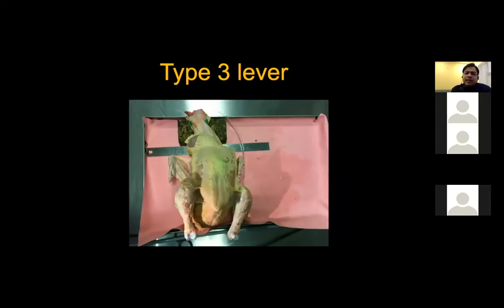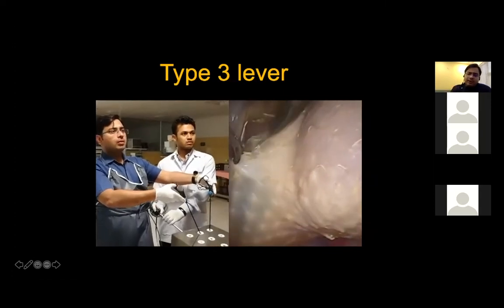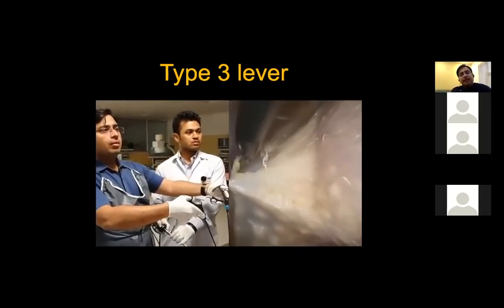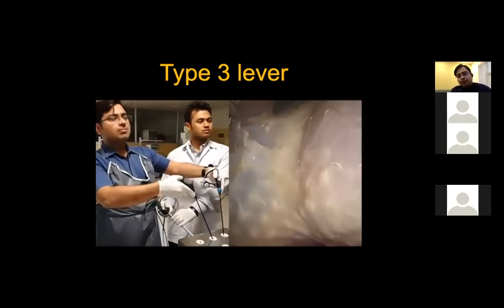One more situation that can arise is that your instrument is too much outside. That means 3/4 of your instrument is outside and only 1/4 is inside. This will lead to an enhanced elevation angle, as you can see in this video.